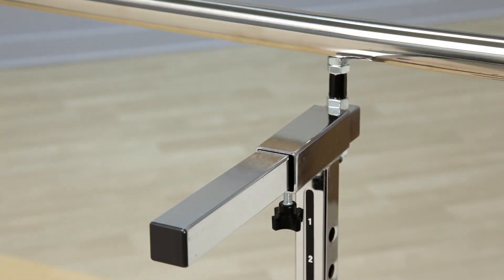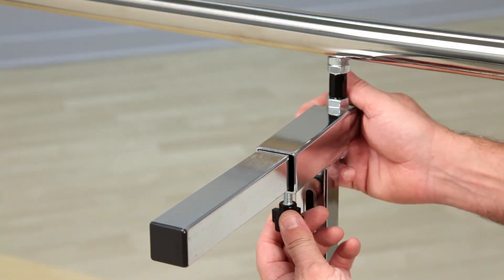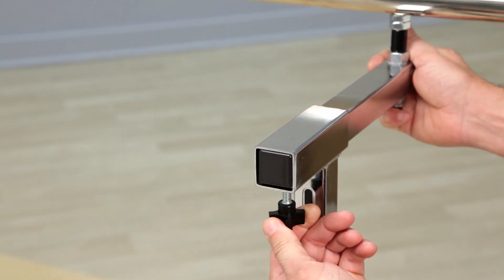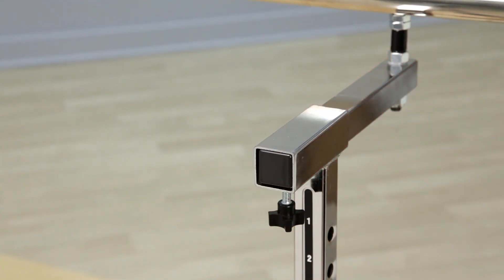Plus, Clinton parallel bars are adjustable two ways. Vary the space between the handrails by adjusting the width adjustments at the top of each post.